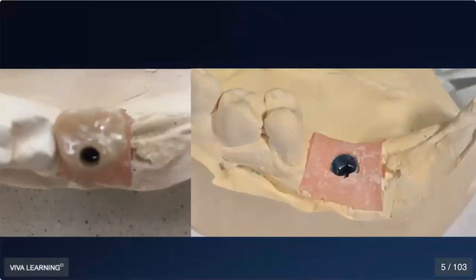Here's a case that we also got two things wrong with. Look at the access hole on the buccal of the implant crown, but also maybe more important, honestly, in my opinion, look at the image on the right, the platform of the implant. It's just not apical enough. It's right at the surface of the gingiva. So angulation and depth in this case were inappropriate, for sure not ideal.